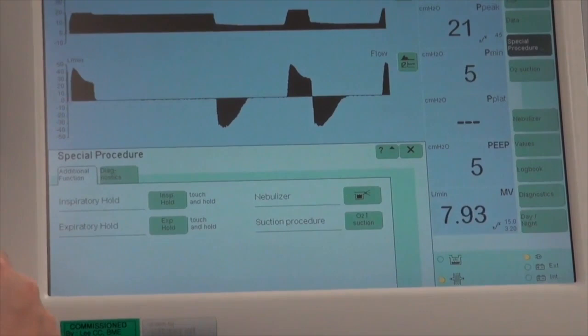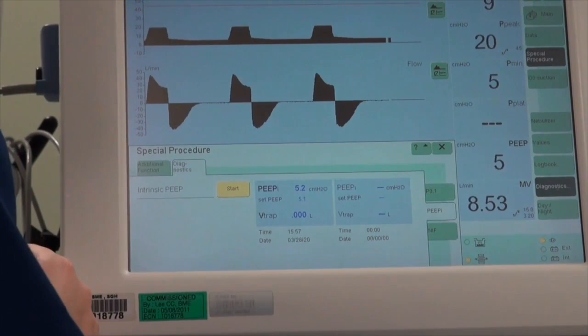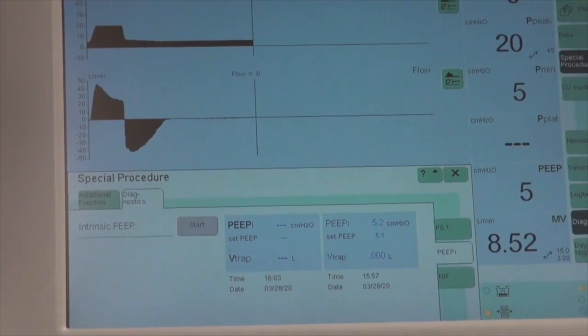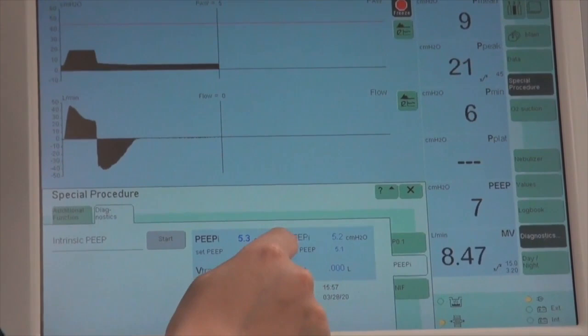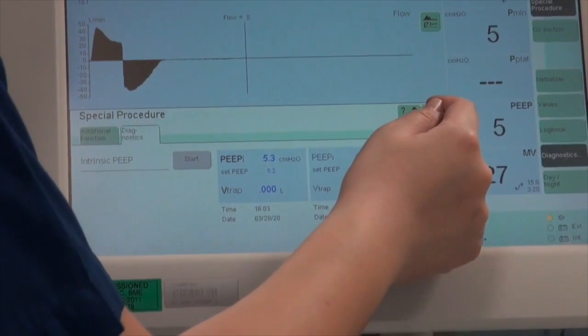The other maneuver available is an Expiratory Hold to look at total PEEP. Go to Diagnostics, then Intrinsic PEEP, and press Start. The display will freeze, and your total PEEP or intrinsic PEEP will be shown on screen. Once satisfied with these values, go back to the main screen.